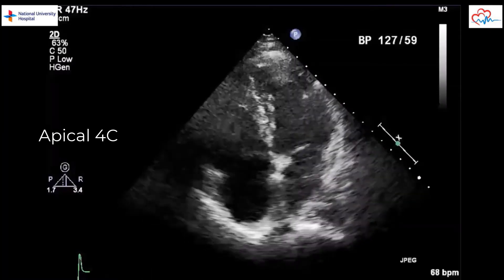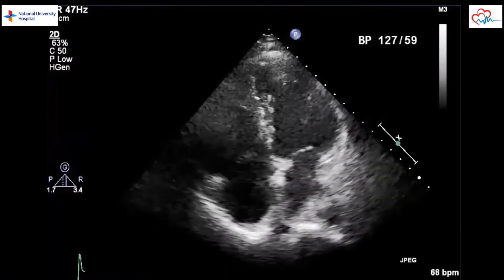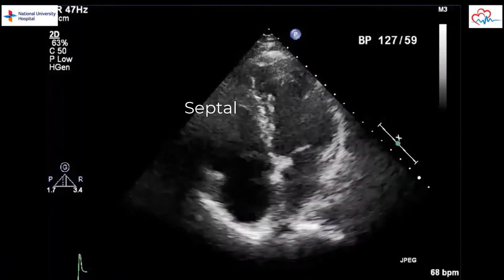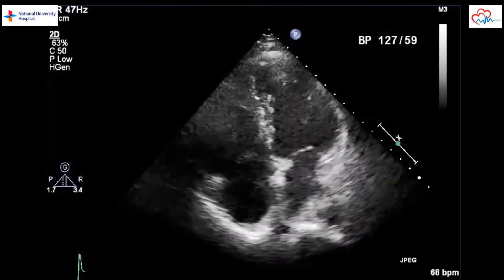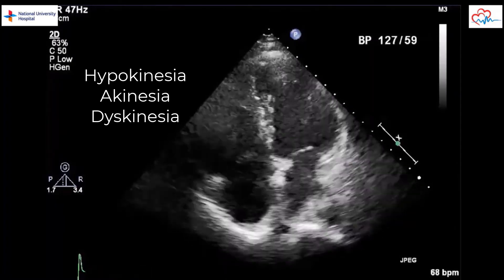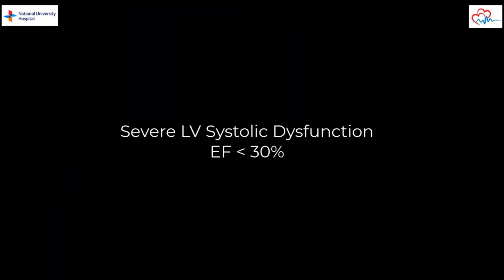Finally, we look at the LV in the apical four-chamber view. Once again, wall thickening and movement are noted to be reduced. The septal wall also appears hypokinetic in this echo clip. RWMA can be described as hypokinesia, akinesia, or dyskinesia. Akinesia refers to no thickening of the LV wall and no movement during systole. Dyskinesia refers to paradoxical outward movement of the LV wall.